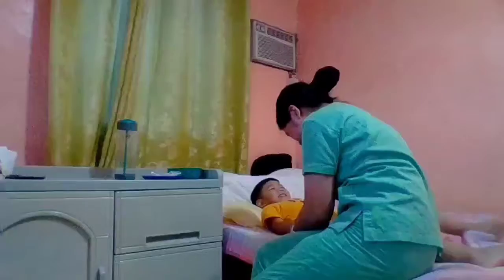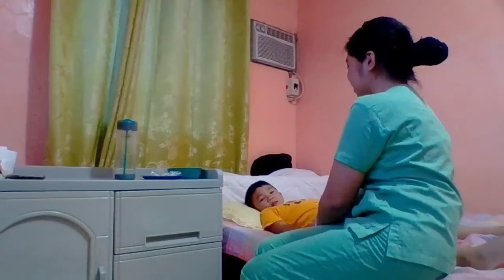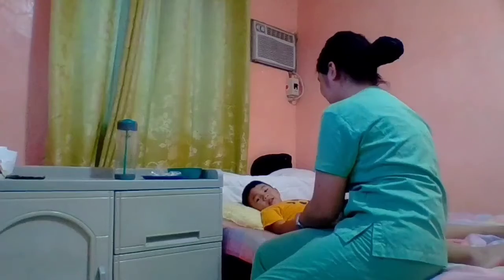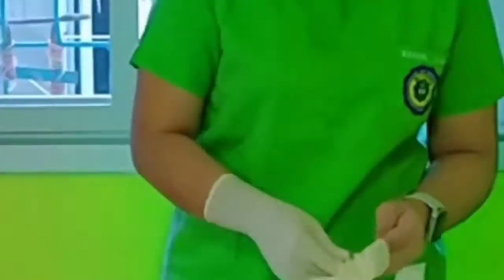Complete necessary assessments before administering medications. Check allergy bracelet or ask patient about allergies. Explain the purpose of the medication to the patient. Perform hand hygiene and put on gloves.